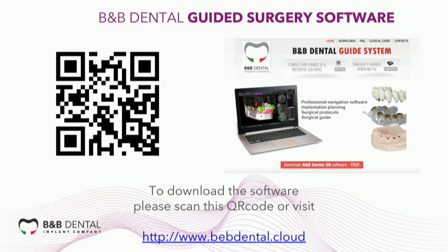This is our website where you can download our software: www.bebdental.cloud. This is a download bar. You can download our software and then install it on your laptop. Then you have to make the subscription. You have to fill the form where you put your name, your last name, your country, and your mail, which is important. And then you can use our software.